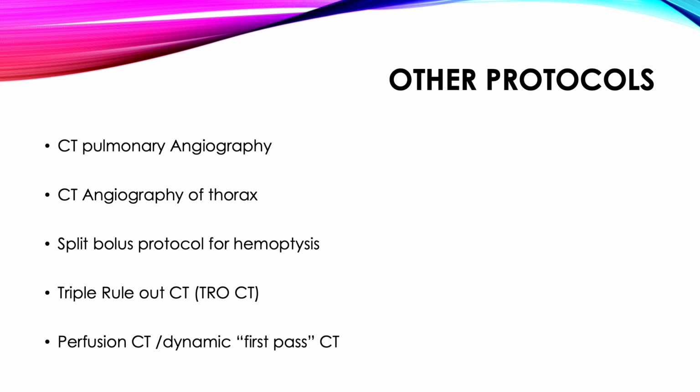We've all heard of CT pulmonary angiogram, which is performed for suspected pulmonary embolism, for follow-up of patients with pulmonary embolism, and for pulmonary artery hypertension also. And whenever we do a CTPA, we do a shallow inspiratory breath hold because we don't want a Valsalva maneuver with a deep inspiration leading to poor vascular opacification. So we do it in a shallow inspiratory breath hold. And CT pulmonary angiography is the gold standard in which we see the opacification of the pulmonary vasculature to look for emboli.